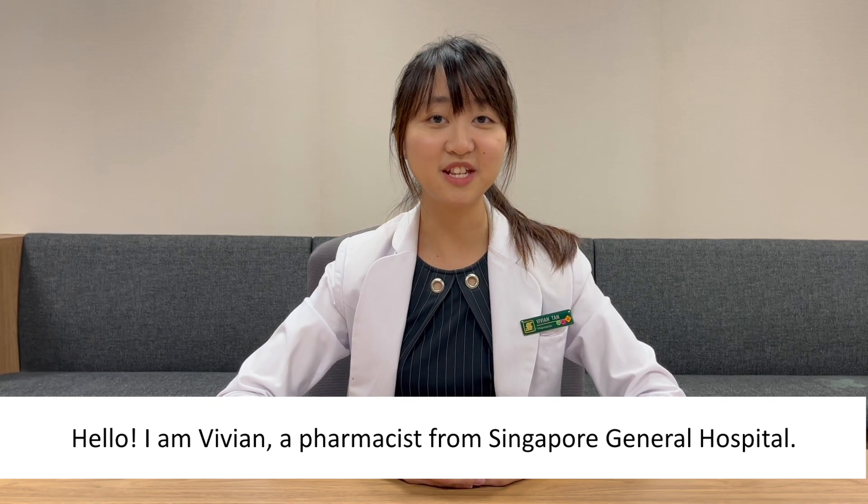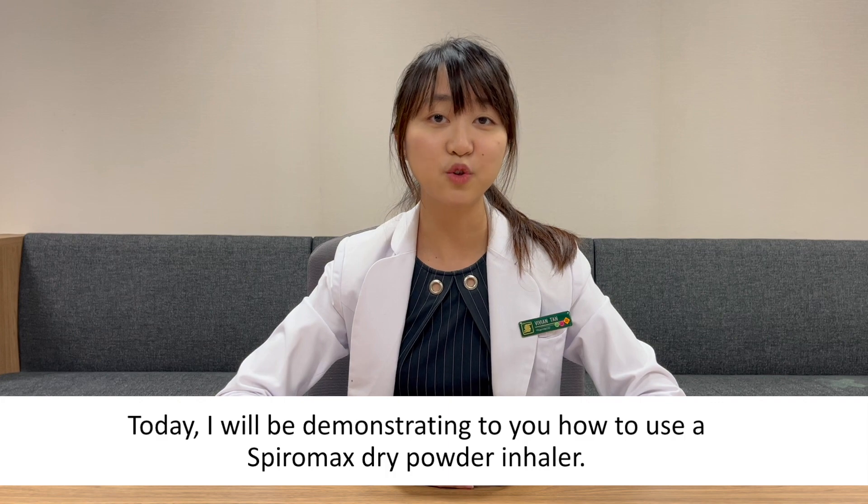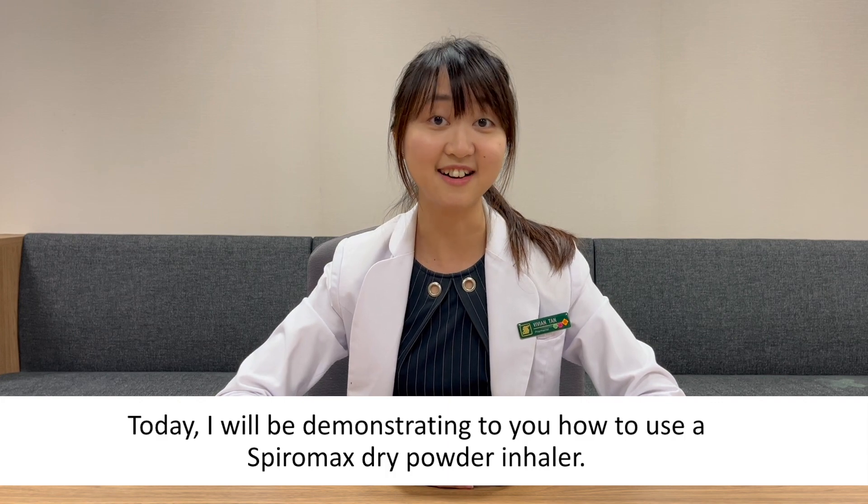Hello, I'm Vivian, a pharmacist from Singapore General Hospital. Today, I'll be demonstrating to you how to use a Spiromax dry powder inhaler.